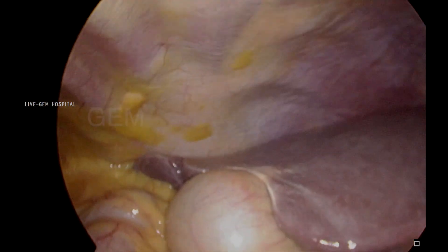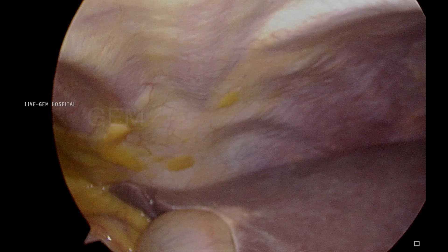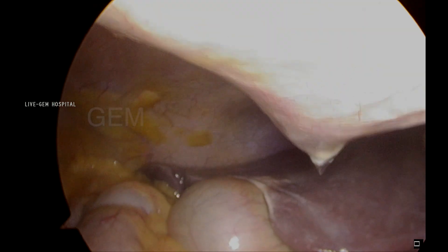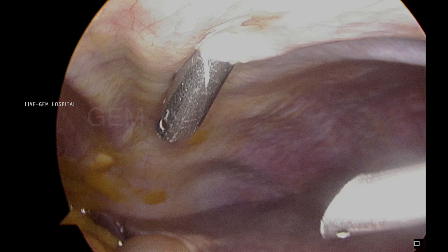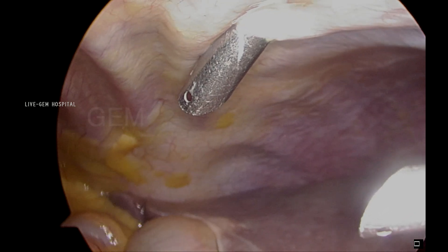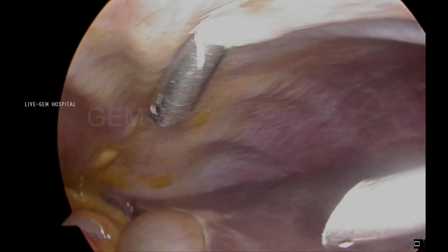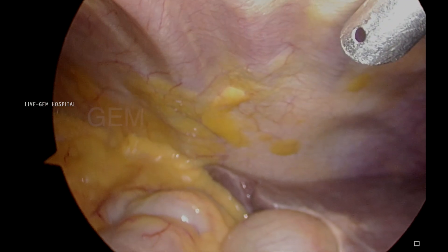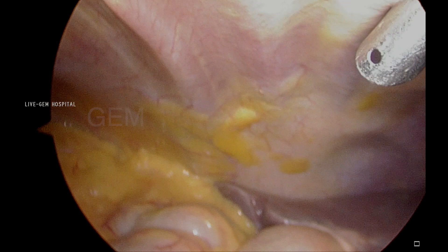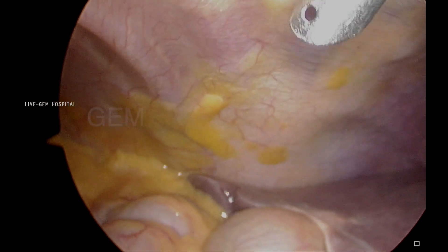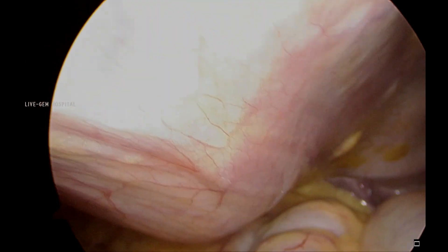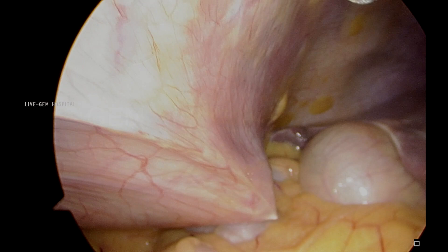When I go for clipping, I will convert this epigastric port into 10mm. This is the subcostal port on the fundus of the gallbladder, and this is the right lateral port — I am making it below the level of the liver and above the level of the colon. During this time the patient position will be head up and right side up.